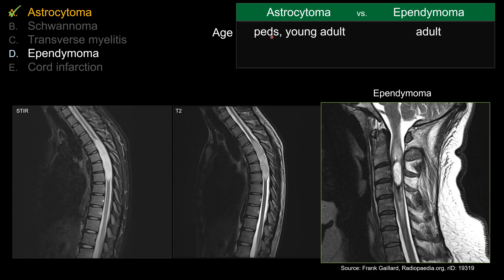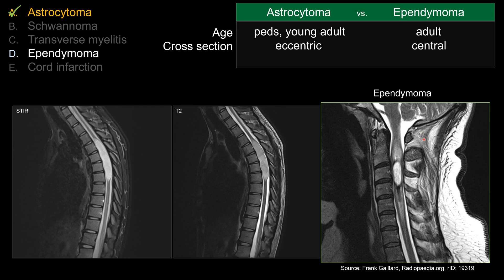For patient age, pediatric patients and young adults tend to favor astrocytoma, whereas ependymoma tends to occur in older adults. Of course there's a lot of crossover — you can have kids with ependymoma, especially those with NF2, and adults with astrocytoma. On cross section, because ependymoma is derived from the ependymal cells lining the central canal, they tend to develop from central outward, so they tend to be central in location, whereas astrocytoma tends to be asymmetric or eccentric.